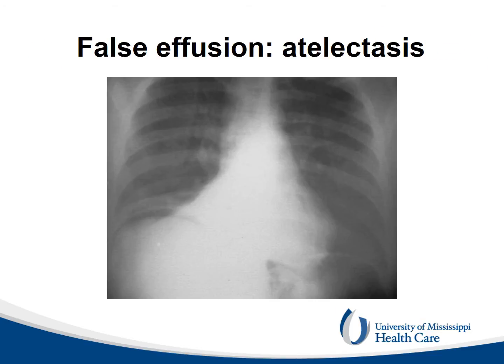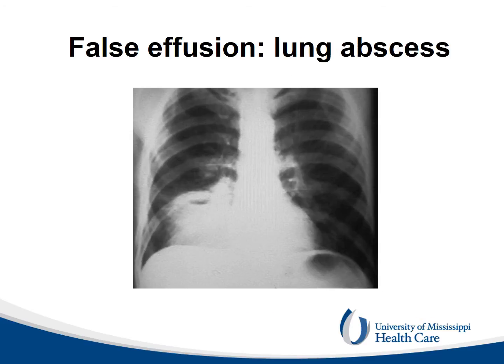Atelectasis of the right middle lobe can give, on superficial view of the postero-anterior chest X-ray projection, the wrong impression of a right paracardiac effusion. The lateral view will clear the confusion. This chest X-ray shows the typical appearance of a lung abscess with an air fluid level, not to be confused with an effusion.